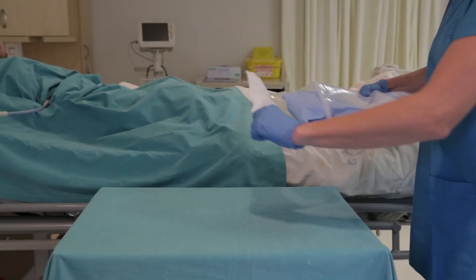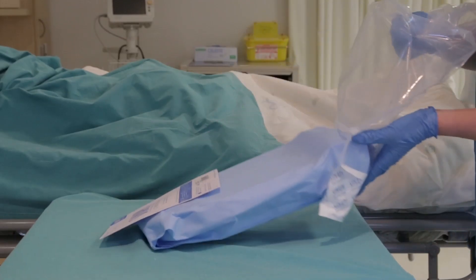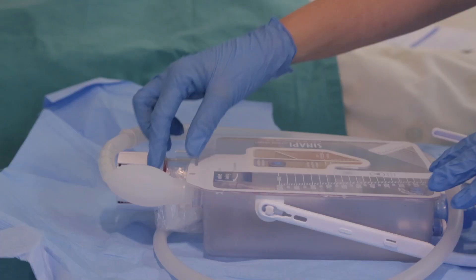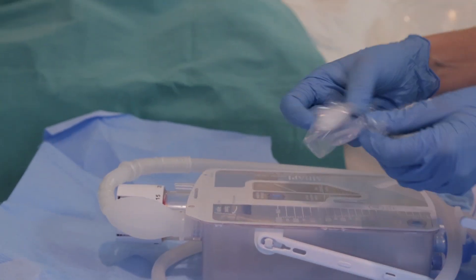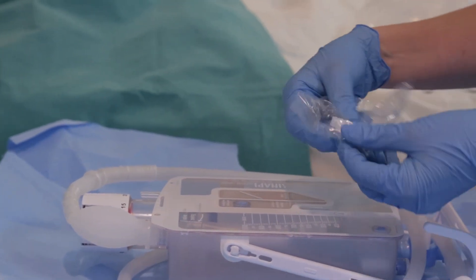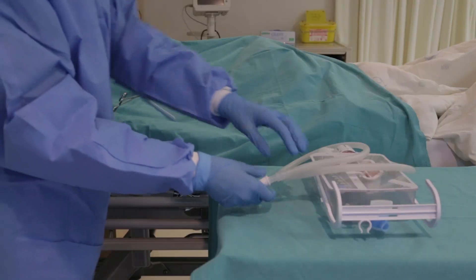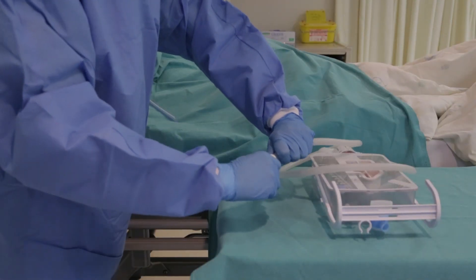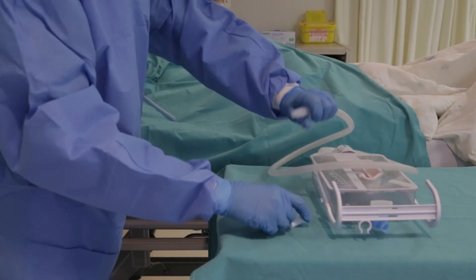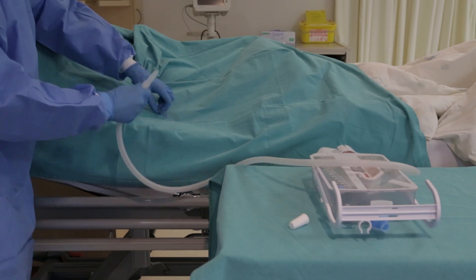Open the package and remove the device from the sterile wrapping. Select the correct size connector and attach it to the chest catheter, ensuring a tight and secure fit.